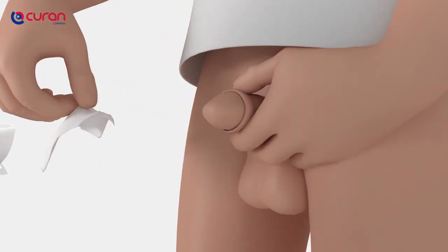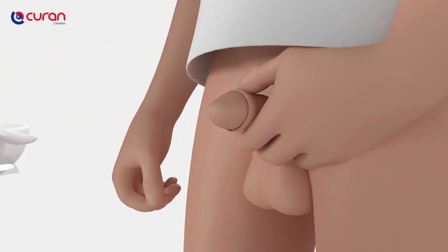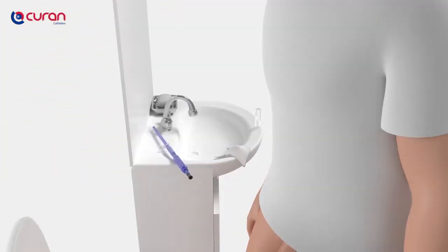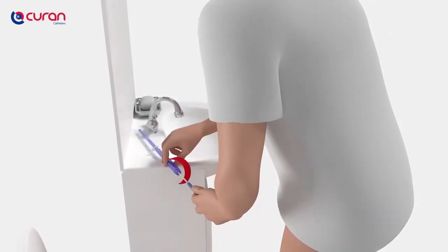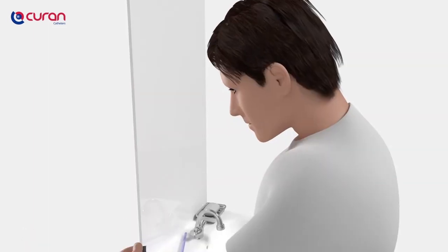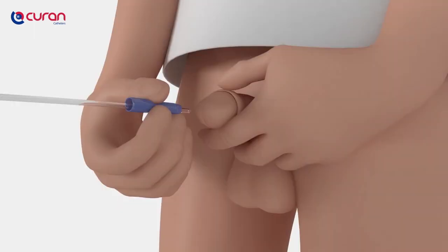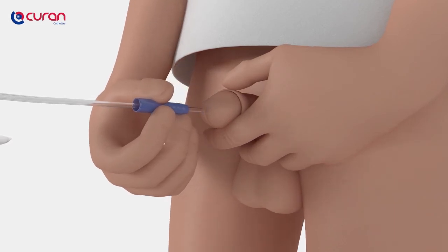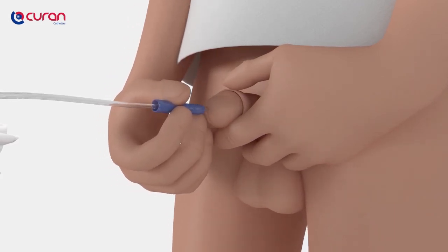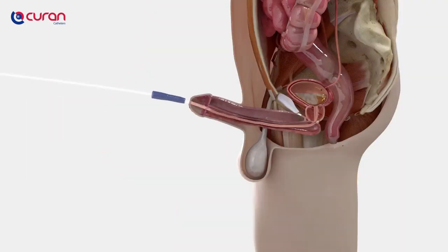Do not touch the tip of the penis to make sure it remains clean. To ensure that the catheter is covered completely with the hydrogel coating, the catheter should be removed slowly from the packaging by holding it by the connector and pulling it free in a twisting move. With the other hand, pick up the Blue Grip and insert the catheter smoothly into the urethra, 2-3 cm at a time. Be careful that the catheter does not touch anything before entering the urethra.